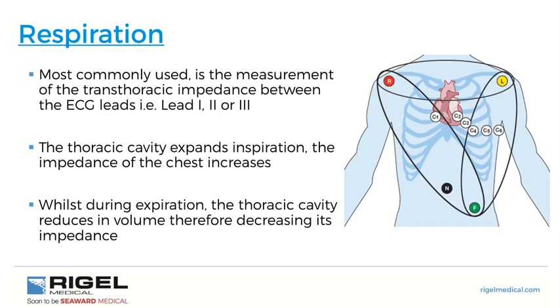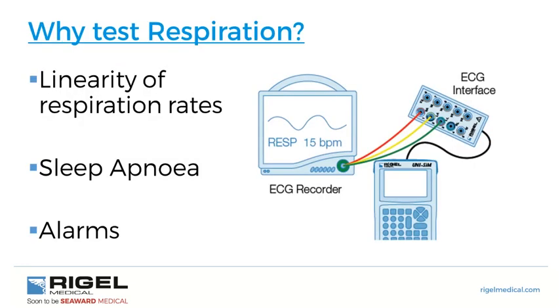And so when the thoracic cavity expands, the impedance of the chest will change, and that's effectively what a patient monitor will pick up. Why test respiration? The linearity of respiration rates, sleep apnea, which is when there isn't any respiration, and the alarms of respiration.